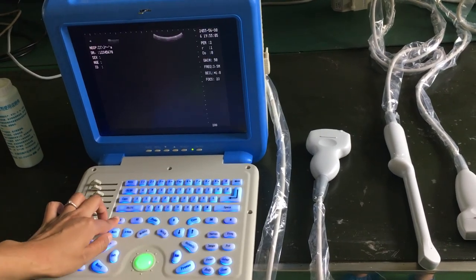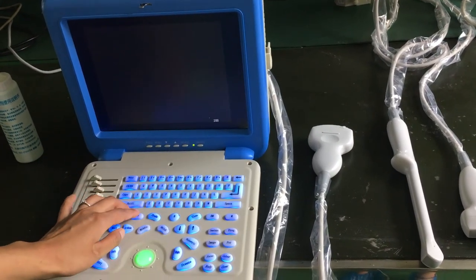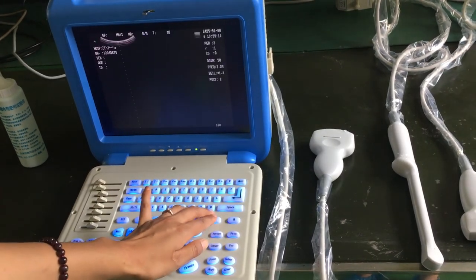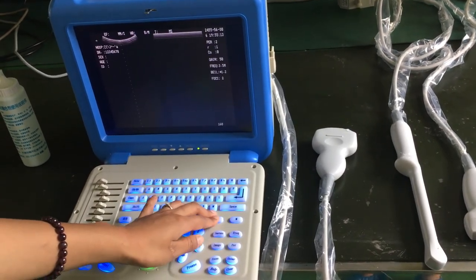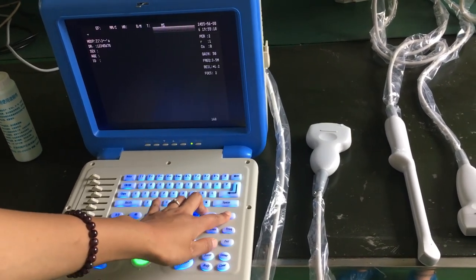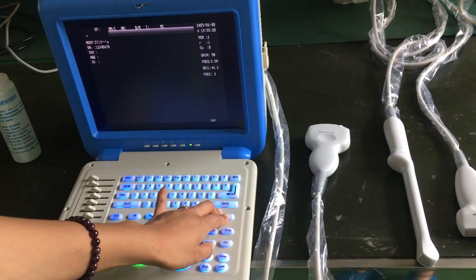We have 2B mode and 4B mode. B/M mode is for heart use, and M mode is also for heart use.